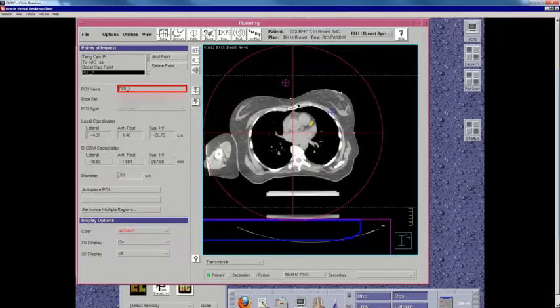Yeah, thanks. So we would have set up points on the patient's skin here and here, and initially set up to these points because this is a very stable place to mark the patient. And you can start there, setting up to there, and then you just drop the couch and move the couch over, and you end up on this point. And then that should also mirror what we've drawn on the skin here and here, the ISO blue, and that's the treatment isocenter. Great. So thank you, Kent. I'm glad you're on the call.